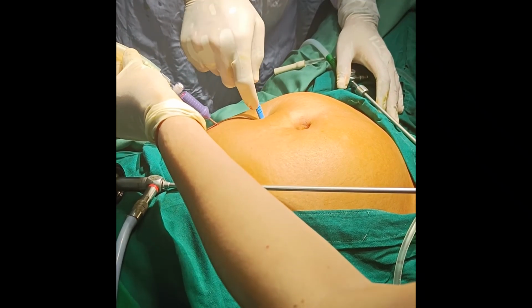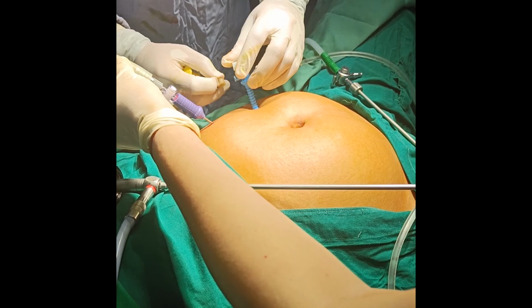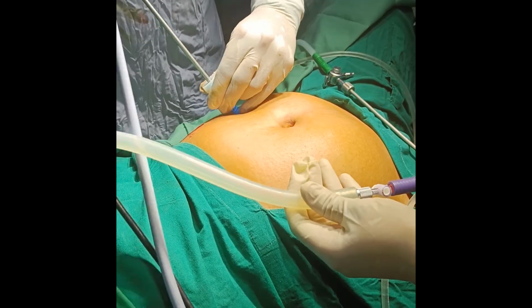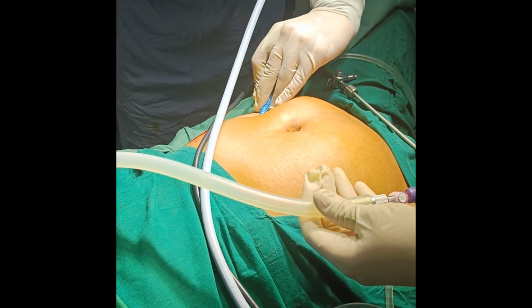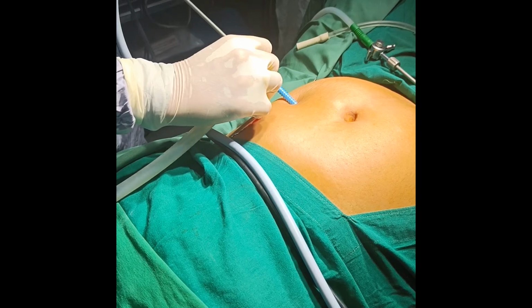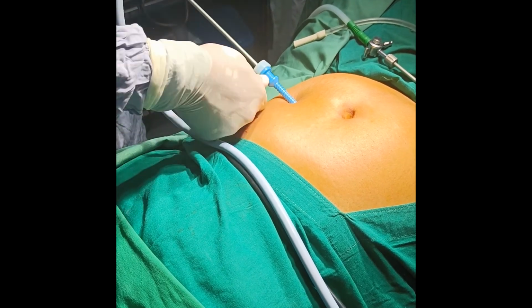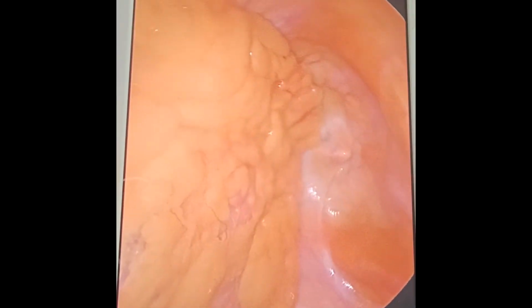Fixing it on the sheath and going in with a purely rotatory movement. Avoid direct thrusting movements because they can be dangerous. When you open the outlet, you should hear a free hiss of gas at that point, which ensures that it's a good entry. And then you can remove the Veress and connect the gas directly to the port. Insert a 5mm scope and then just ensure the entry by seeing your screen at that point.